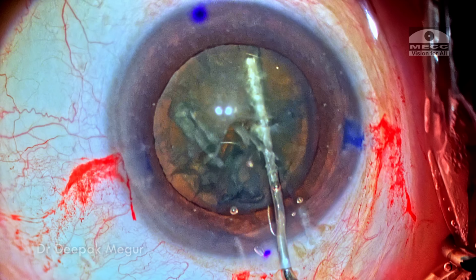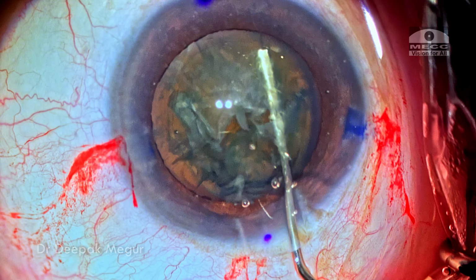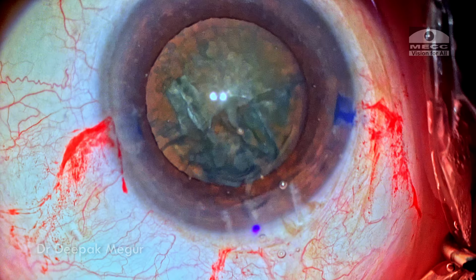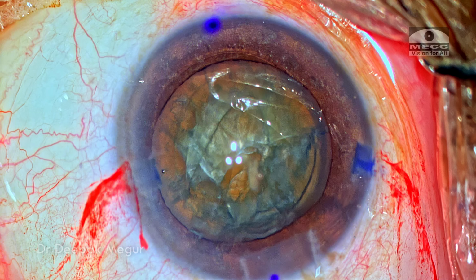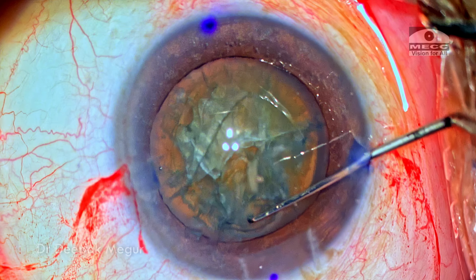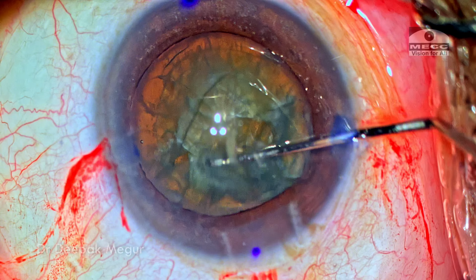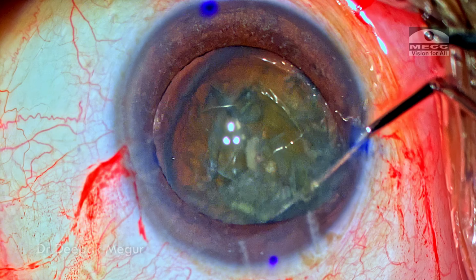I'm attempting to perform hydrodelineation, but it doesn't seem to produce any golden rings. I don't want to use any excess fluid. I just stop there and come out. I'm refilling the chamber with just a little bit of OVD. I'm using a Sinskey hook just to confirm that the nucleus mobility is there. I'm just rotating the nucleus a couple of times, which ensures that the nucleus is mobile.